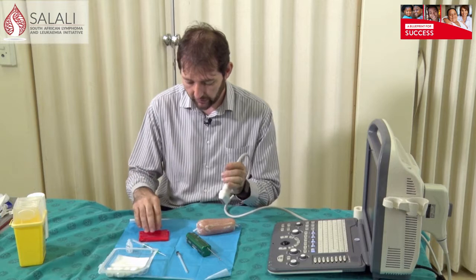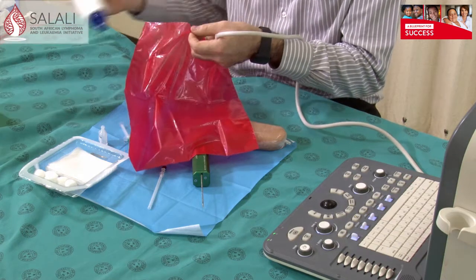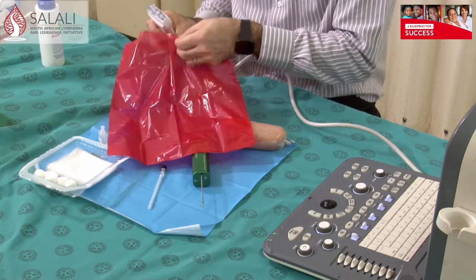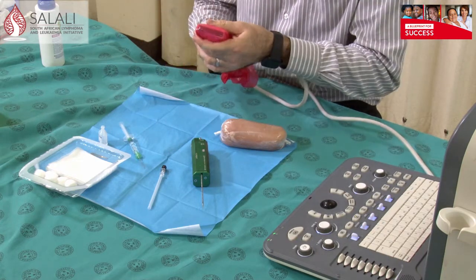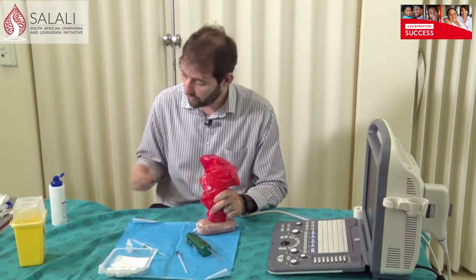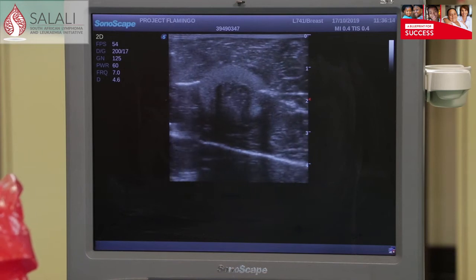What I use, which is easily available, is the red bag that comes with the dressing tray. I put a little bit of jelly on the end of the ultrasound probe and slide it into the bag — it's covered that way. Just make sure you can feel your little notch so you can get your orientation right. If you want to put jelly on the skin as well, use a sterile jelly, as it often helps give you a better picture.